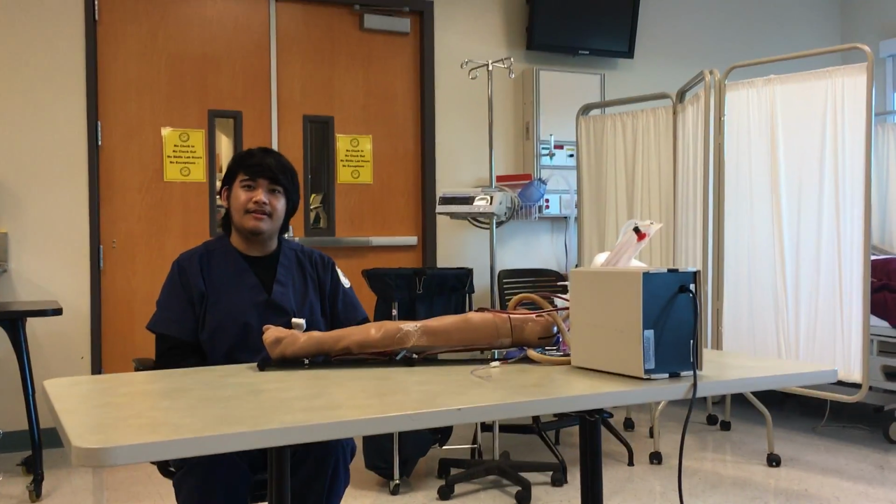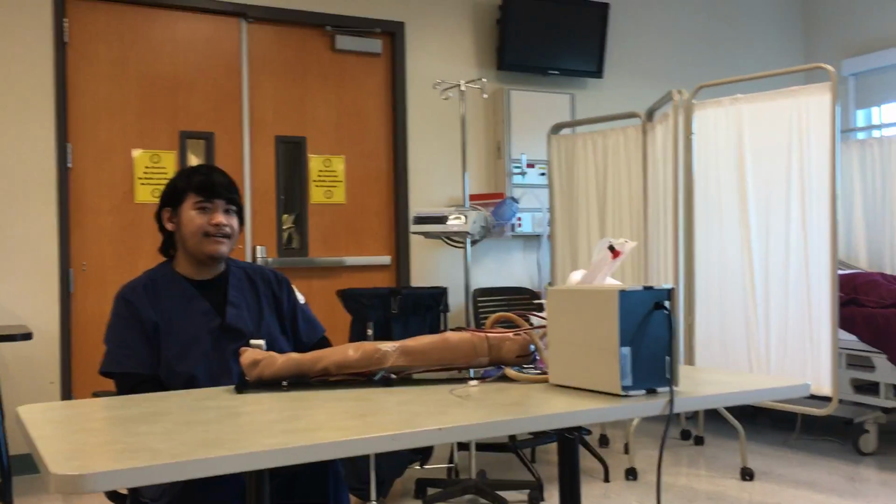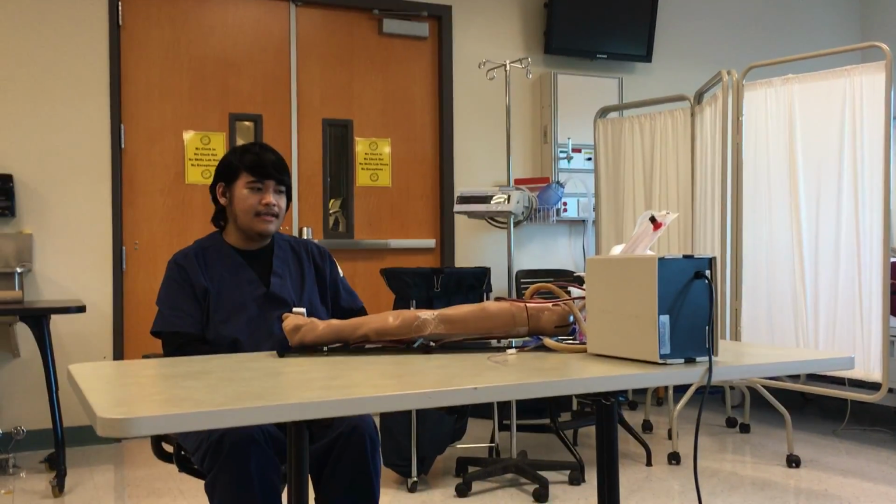Hello, my name is Delo, and today we are going to do an arterial blood gas test.